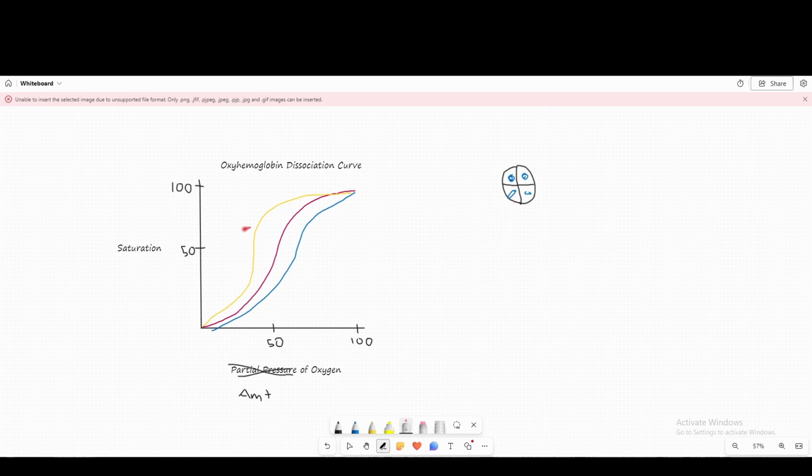That hemoglobin is going to be holding onto that oxygen incredibly tightly, which means you're still going to have a high saturation at most points, especially in the tissues, right? Because this oxygen is going to be brought in through the lungs, bind to the hemoglobin through gas exchange, and that hemoglobin is going to grab onto it so tightly it's not going to want to let go, which means that you're going to have a high SpO2 because a lot of your hemoglobin is saturated, but your tissues aren't going to be getting that oxygen, which means you can still be hypoxic with a high saturation, right?